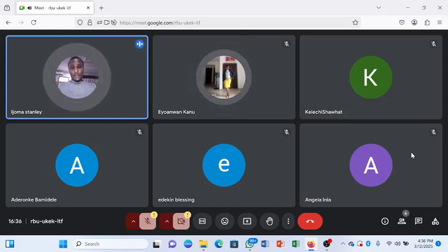Some will have blue, some will have a red cap, but they are bigger than the bottles used for collection of blood specimen. So they are a different kind of bottle altogether. So that when you start discussing tubes, you don't bring in a bottle or container for collection of stool or urine sample.